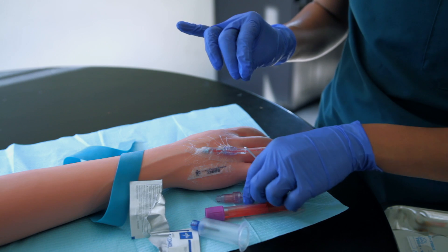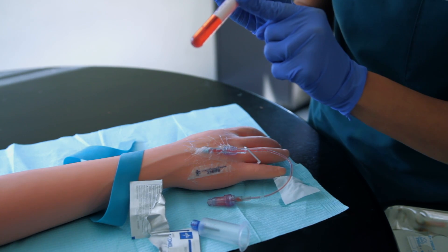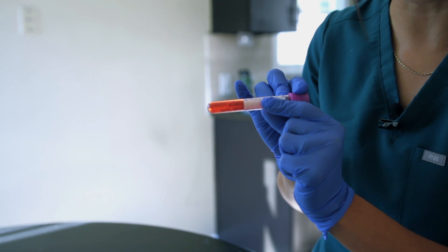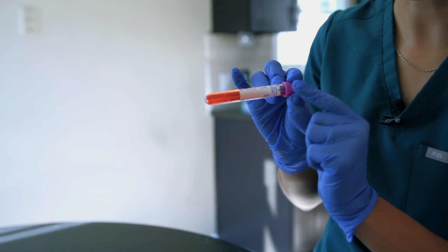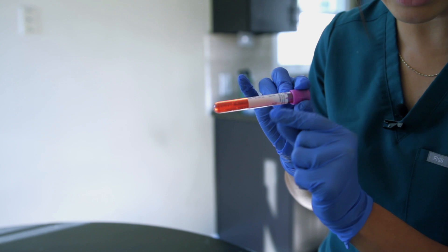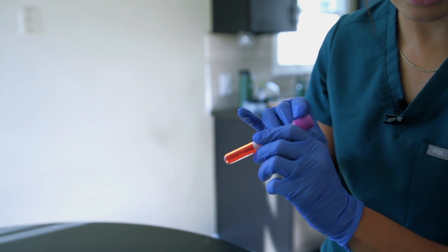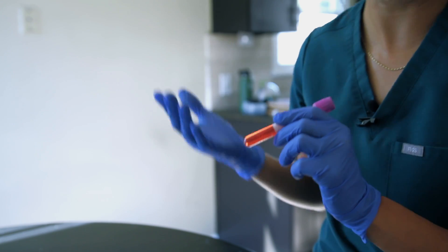I'm going to flush this with 10cc's of saline, then label my specimen and put it in a biohazard bag to send to the lab. I'll make sure I've documented appropriately, scanned the patient and the label, sent it to the lab, and then I'll wait for my results.